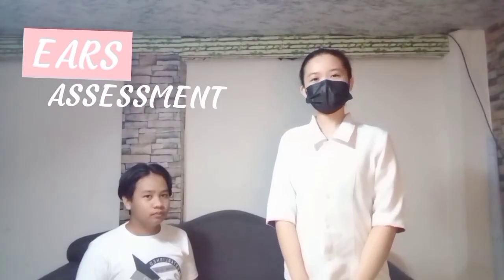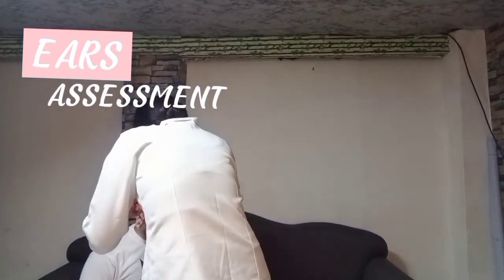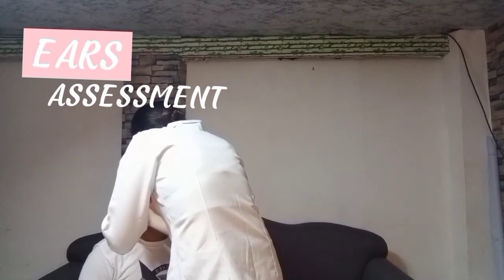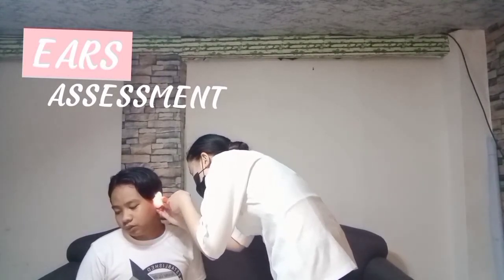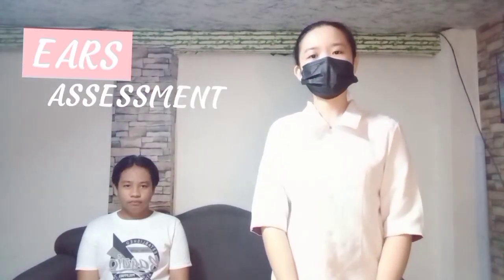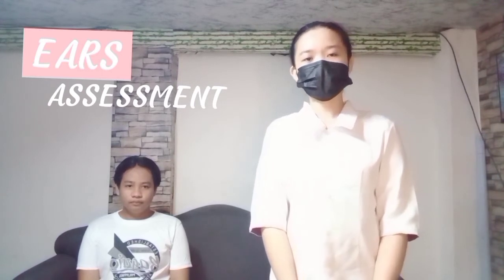So now we're going to assess the patient's ear canals and tympanic membrane. So I'm going to touch your ear, okay? Okay po. Do you feel any pain as I'm pulling your ear? Nothing po. Okay. Another one. Do you feel anything? Nothing po. Okay. So the patient's ear canal is the same color as the ear, and there are no foreign bodies present. There is cerumen or wax, which is totally normal for the patient.